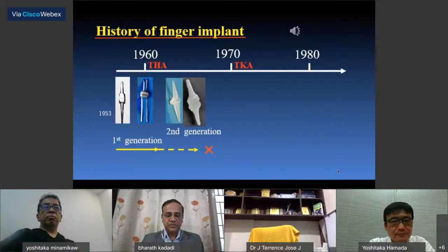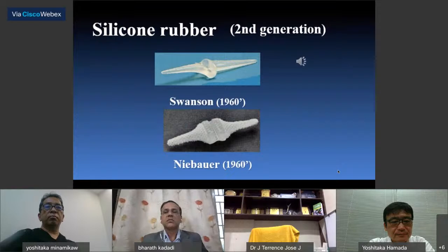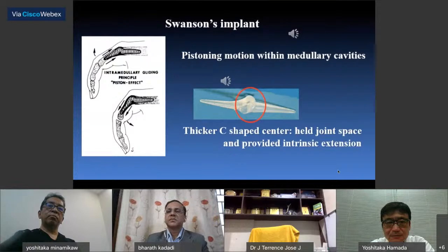Swanson and Niebauer developed silicone implants almost simultaneously, but different in design and mechanism, in the early 1960s. The Swanson implant allowed pistoning motion within the intramedullary cavities, because the C-shaped center held the joint space apart and provided some intrinsic extension.